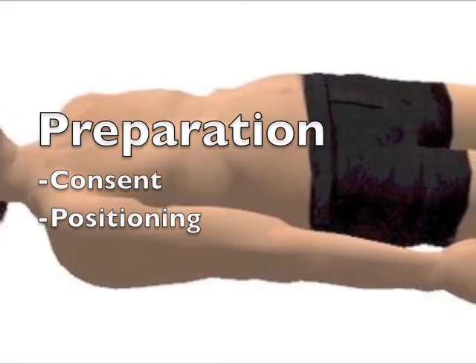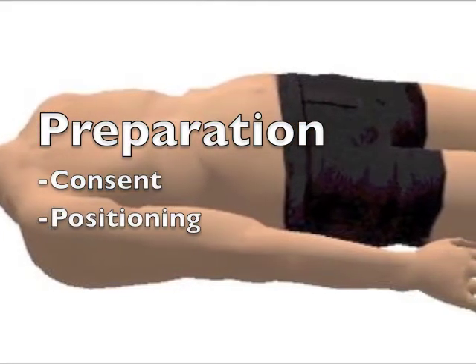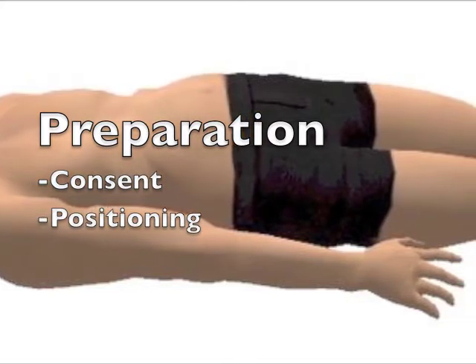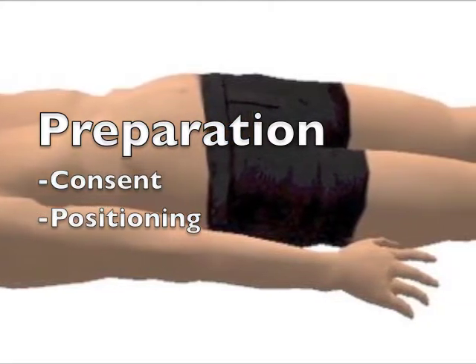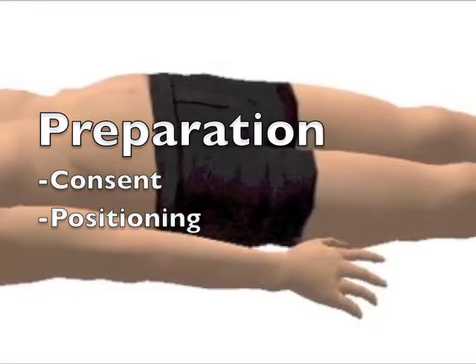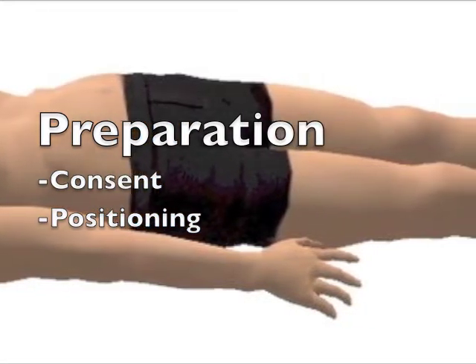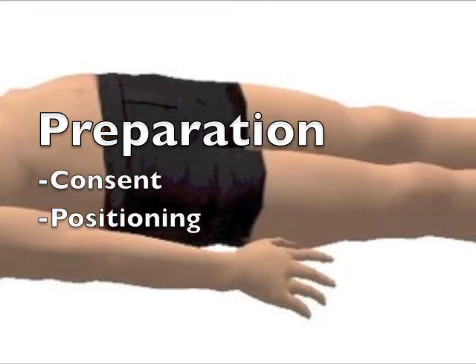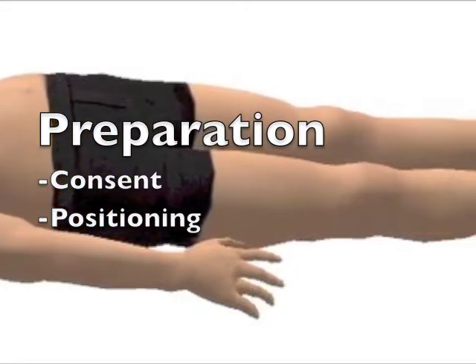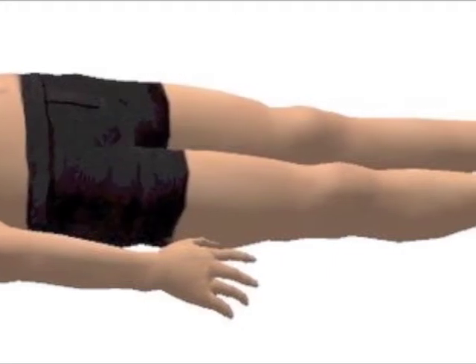As with any medical procedure, it is essential to first have the patient's consent to proceed with the catheterization. Along with this, the patient should be positioned properly. The male should be supine on a bed with adequate padding underneath for any fluid leaks that may occur, and females should be supine in the frog-leg position. It's equally important to ensure all of the necessary equipment is ready and available. It may be wise to enlist an assistant to help you.